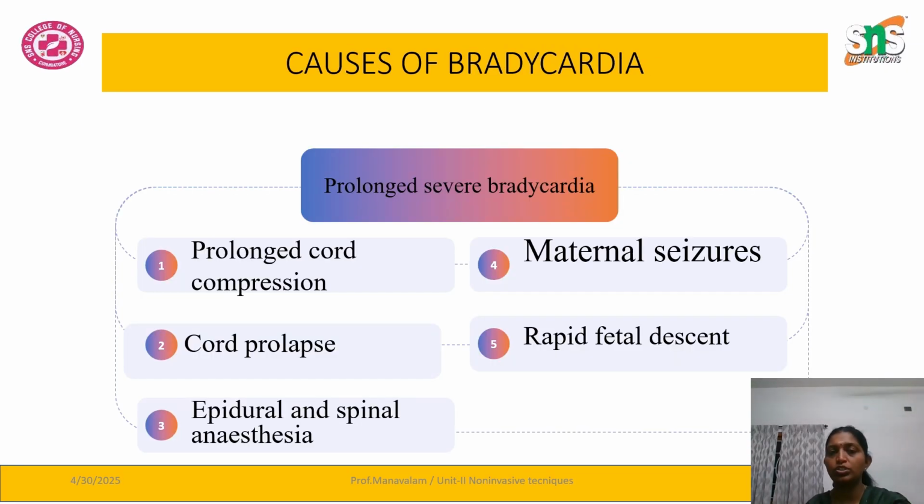Next, move on to the causes of prolonged or severe bradycardia. The first reason may be prolonged cord compression. It occurs while the fetal head is descending during uterine contraction, and it is commonly present in case of low-lying placenta.